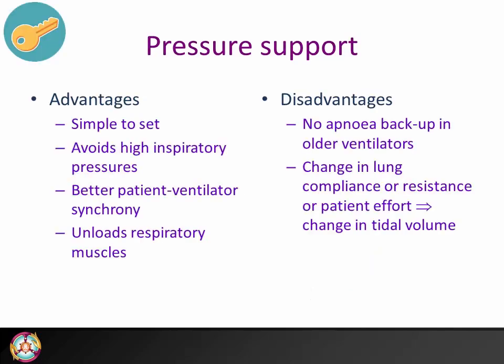The advantages and disadvantages of pressure support are shown here. It has the advantages that it is simple to set, avoids high inspiratory pressures, results in better patient ventilator synchrony, and unloads the respiratory muscles. However, changes in lung compliance, resistance, or patient effort may result in changes in tidal volume.